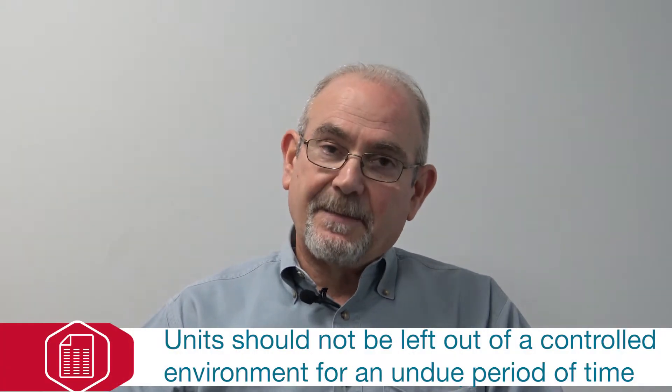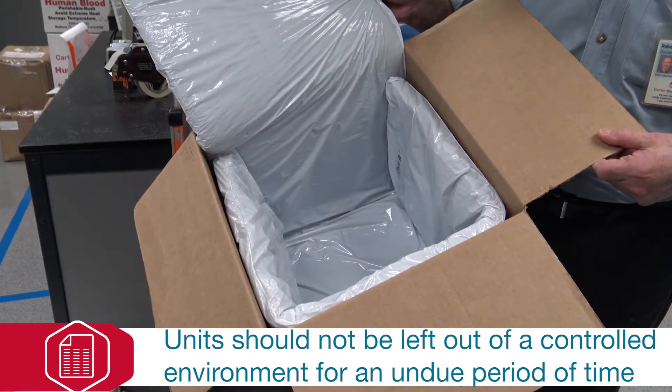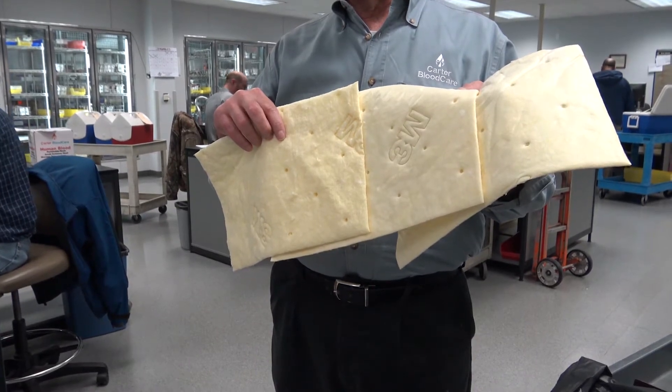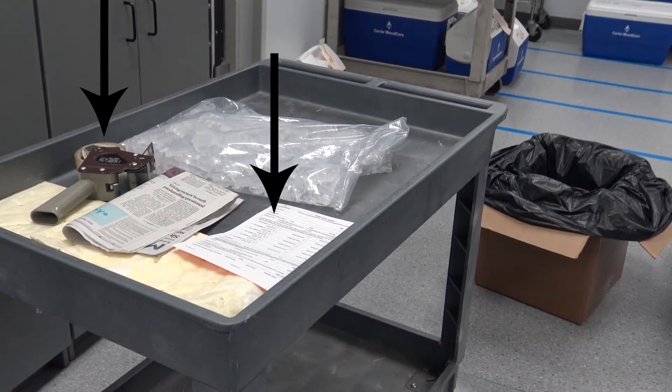Prior to removing the red blood cells from the refrigerator, you're going to want to assemble your packing materials. This includes a clean undamaged shipping box, 5 to 7 pounds of bagged wet ice, absorbent material, packing tape or duct tape, a hand-ship ticket form, and a plastic trash bag of some kind.